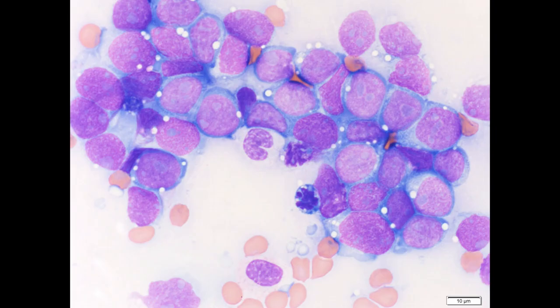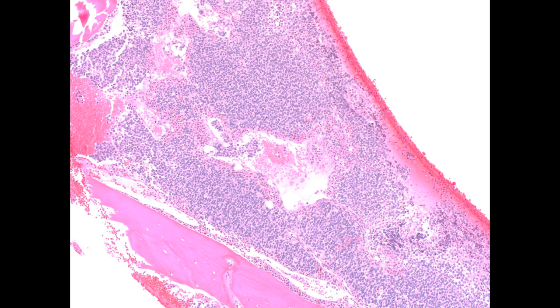When we got the bone marrow aspirate, you could see more of these cells, but here on the aspirate, you have these somewhat discohesive and yet somewhat cohesive cells. This is pretty typical of this disorder. Often these vacuoles have a pearls-on-a-string kind of appearance. Here's the bone marrow biopsy, which looks very different than leukemia.